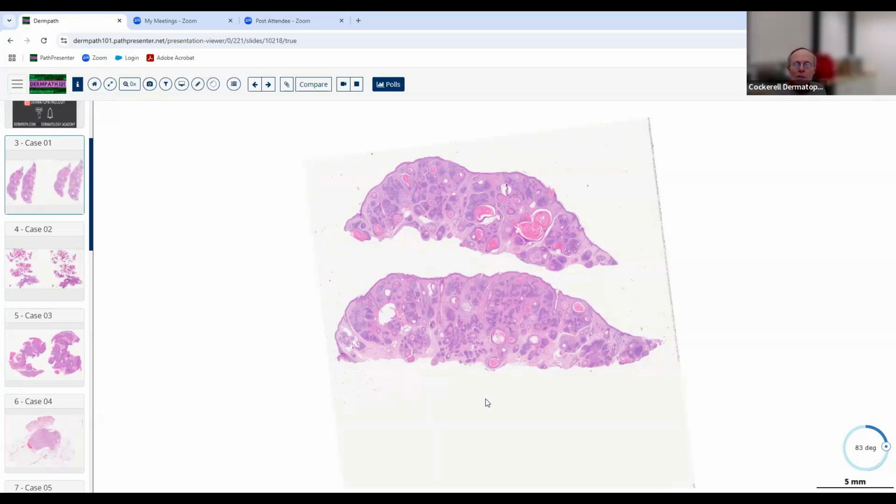And then the next question is, is it epithelial or non-epithelial? Okay, so again, keeping it simple, non-epithelial, we think of three things, basically: neural, muscle, fibrohistiocytic. And those are usually spindle cells. And at low magnification, you can see, well, this is not spindle. There's no way this is a spindle cell process. So it's going to favor epithelial, not non-epithelial.